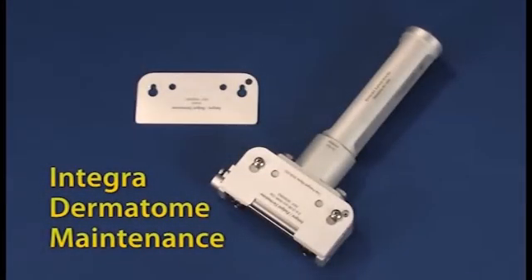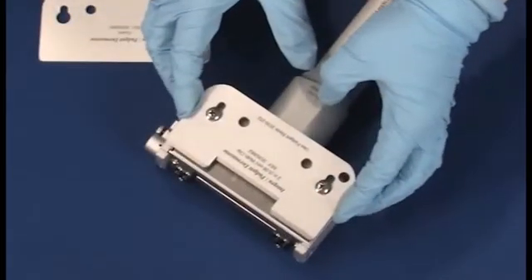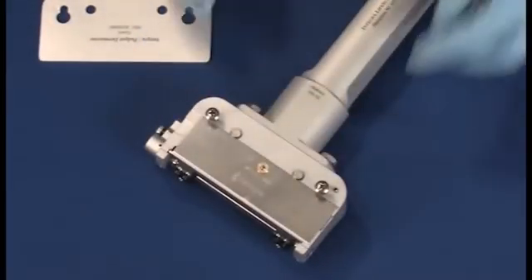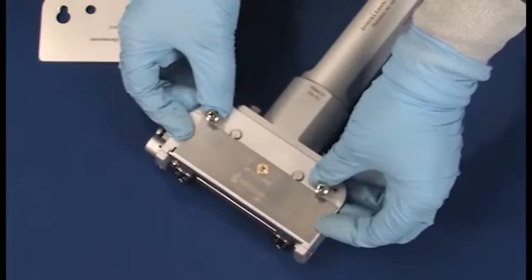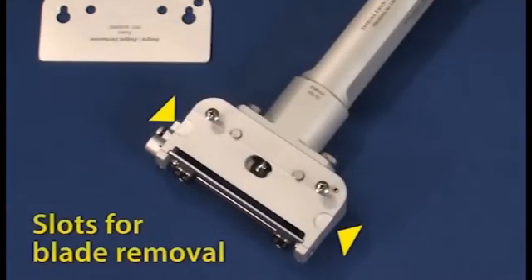To disassemble the dermatome, simply unscrew the width clip with the screwdriver and lift it off. Then remove the blade by lifting up with both index fingers using the slots at the end of the blade. Finally, replace the guard plate.